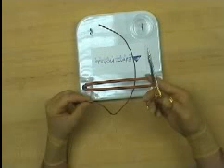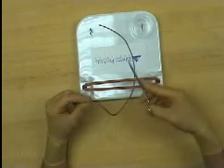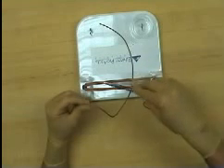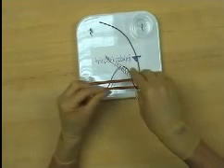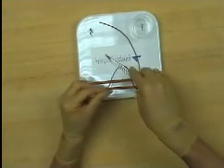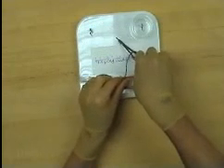Often, when suturing skin, it may be useful to perform an instrument tie, since the needle holder will already be in your hand. In this demonstration, the tail of the suture is lying on the knot board, and the rubber tubes simulate the two wound edges to be approximated.